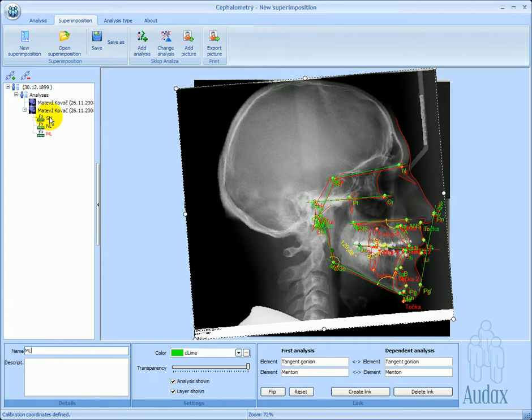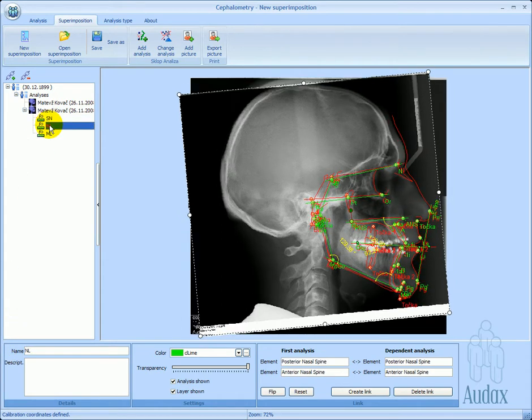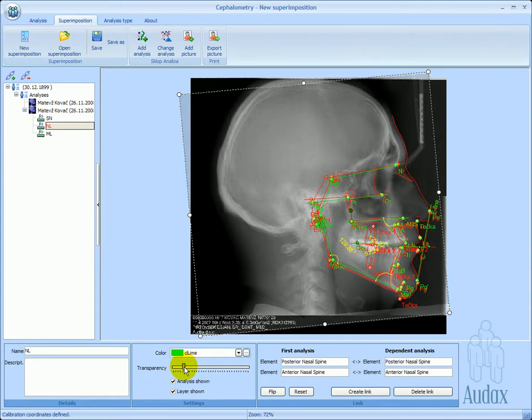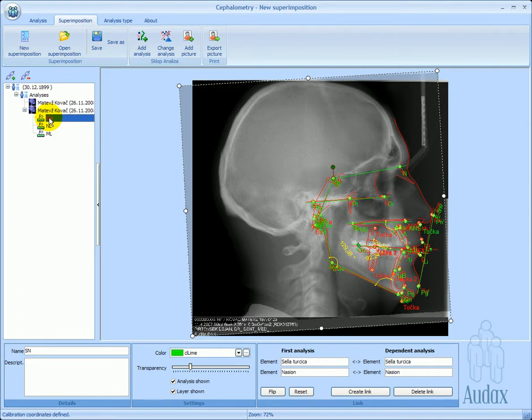Individual links can be selected by clicking on them. For each analysis, the transparency factor can be defined.